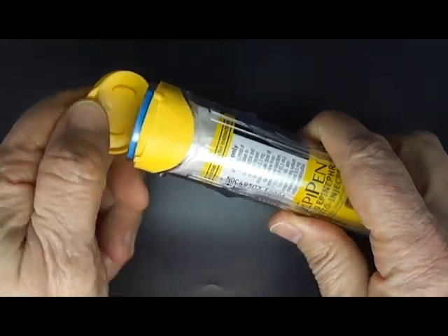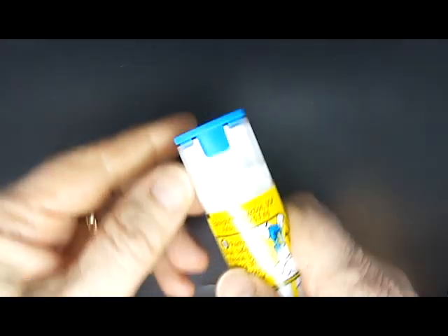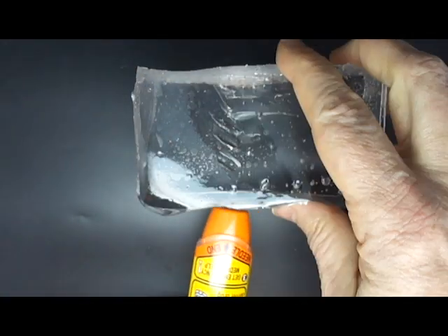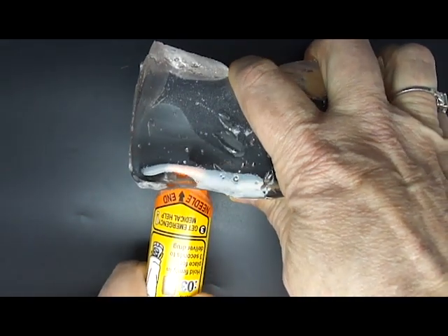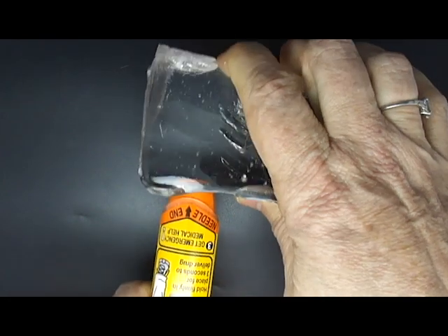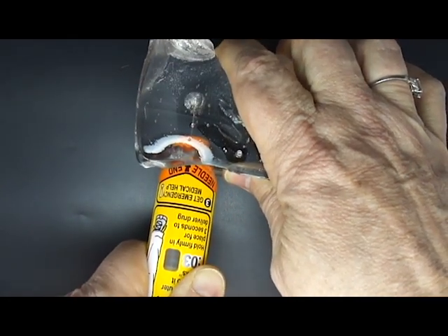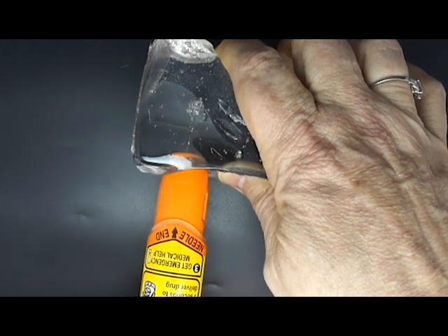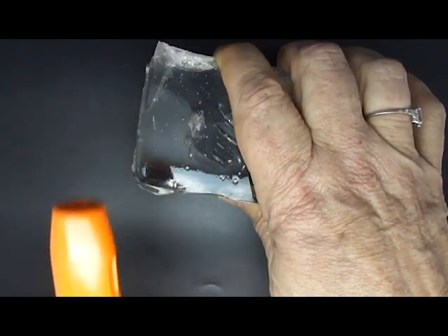First we take the EpiPen out of its case and remove the blue safety cap. One, two, three — we hold it for three seconds, and as it comes back you can see that the needle cover comes down over that needle and there's no exposed needle.